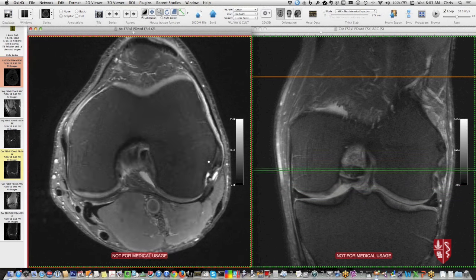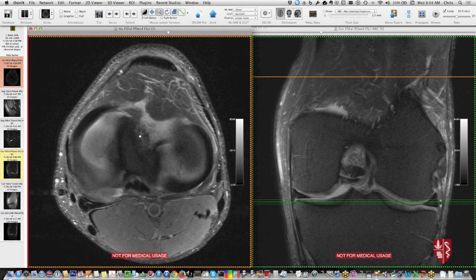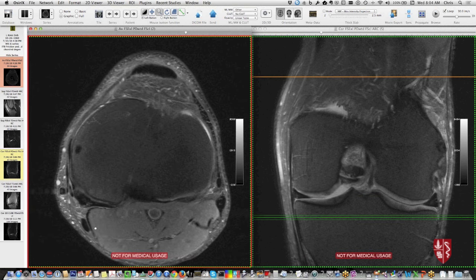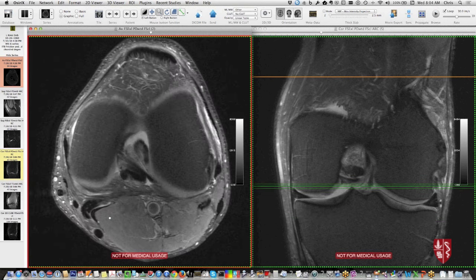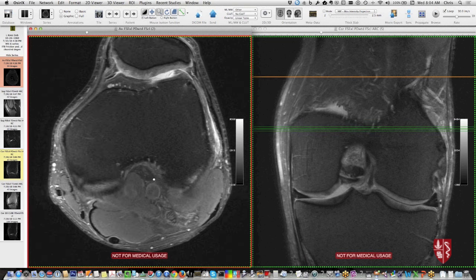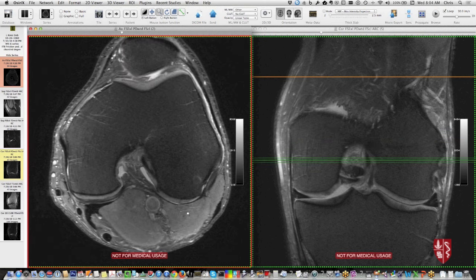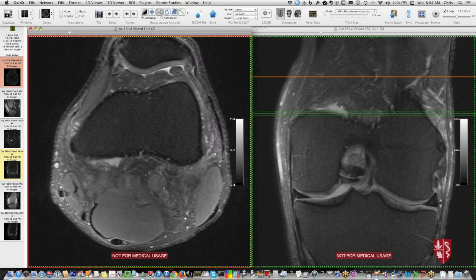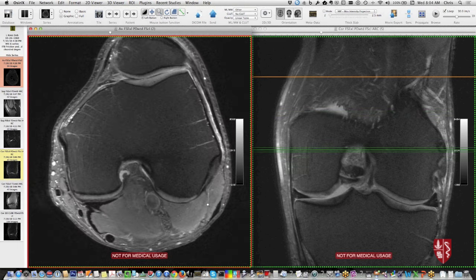Miscellaneous things to check on axials: fluid in the region of a Baker's cyst between the medial gastrocnemius and semimembranosus, fluid around the pes anserine tendons, and the popliteal fossa — checking that vessels pass through without deviation or possible entrapment by the gastrocnemius muscles. The tibial nerve and common peroneal nerve are also visible on axials.